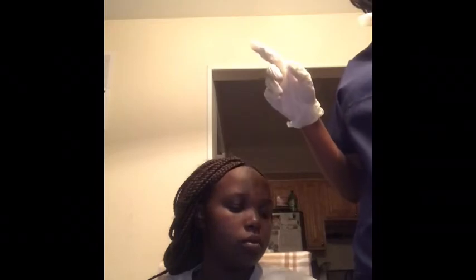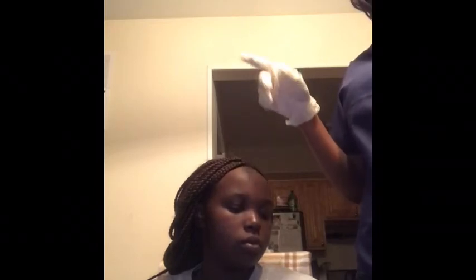So right route, right dosage, right time, and the right documentation. Okay, so here I already washed my hands prior, and I already have my gloves on.